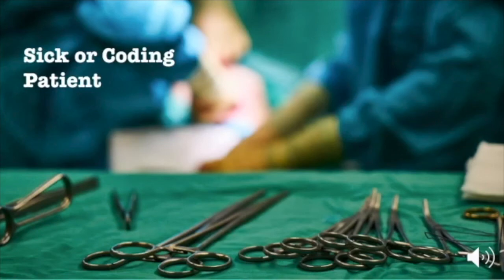So that's an unstable arrhythmia. What if you show up on scene and the patient's actually in a stable arrhythmia? There's no chest pain, they're not syncopal, there's no dyspnea, their vitals look fine, etc. In that case, your end goal is to get them to the nearest hospital quickly for pharmacological intervention. Depending on your protocols, you might be able to start some of these drugs during transport.